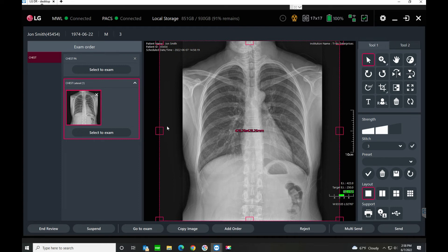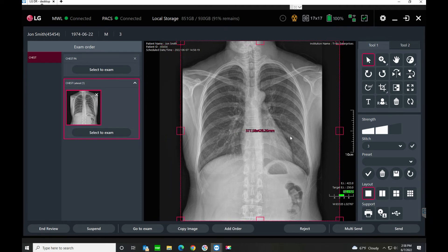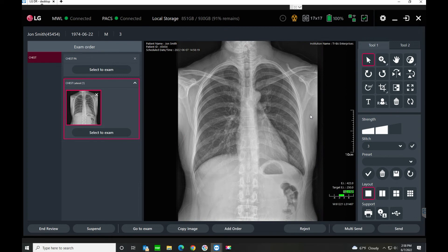You can see this fuchsia square here is the auto collimation. I can just double-click inside here and it would invoke that collimation for me. Or if I want to change it myself, I can tighten it up, double-click inside, and now I've made my collimation.